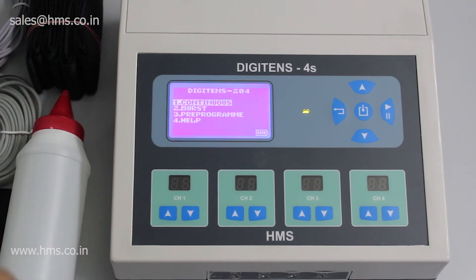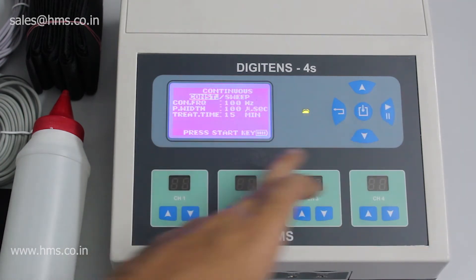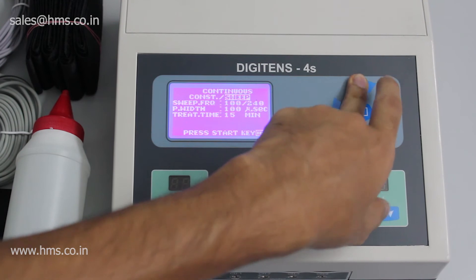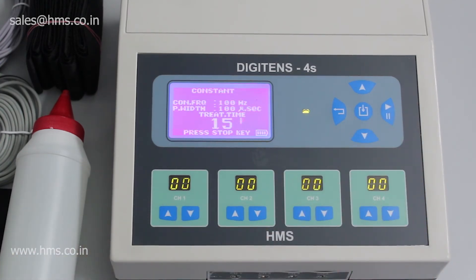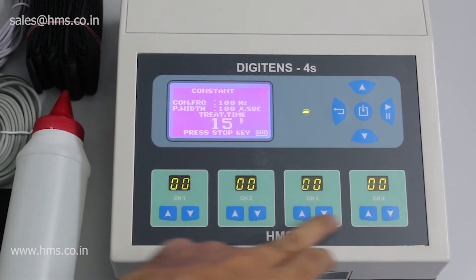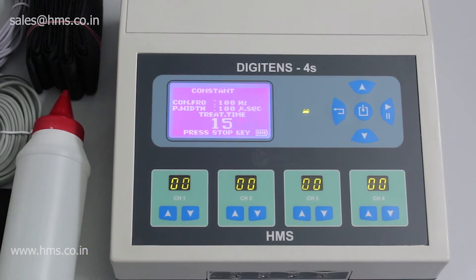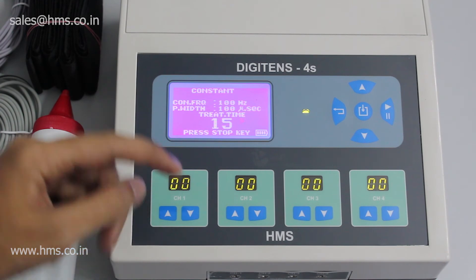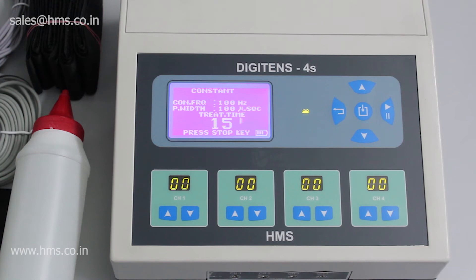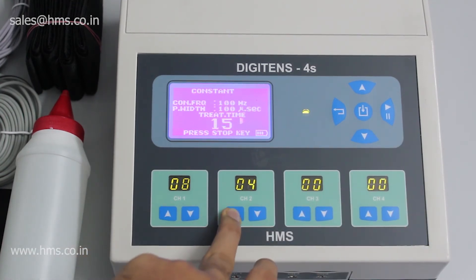Now let's look at the different modes available with the 4S. In continuous mode you have continuous and sweep — you can set your own frequency, and I'm selecting continuous mode here. You can set your own frequency, pulse width, and treatment time, then start the treatment. The 4S features digitally controlled intensity, unlike manual TENS devices which have intensity knobs that can sometimes cause a sudden surge of power, making the patient feel uneasy. That issue is prevented with the DigiTENS 4S, as you can increase the intensity separately for all channels.